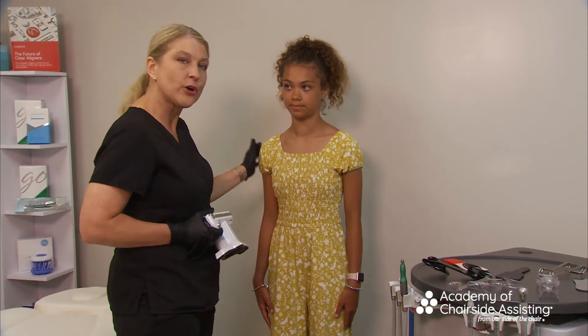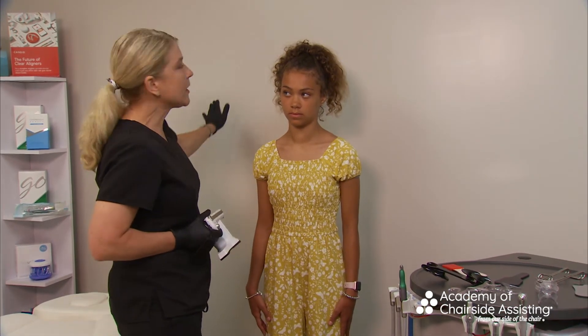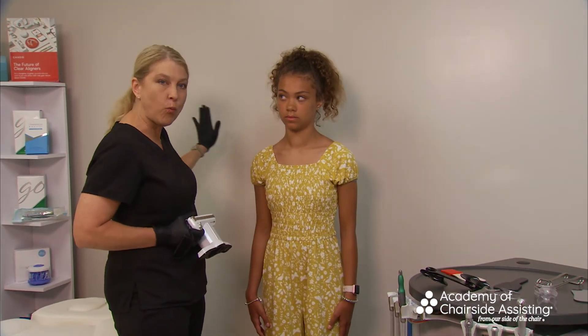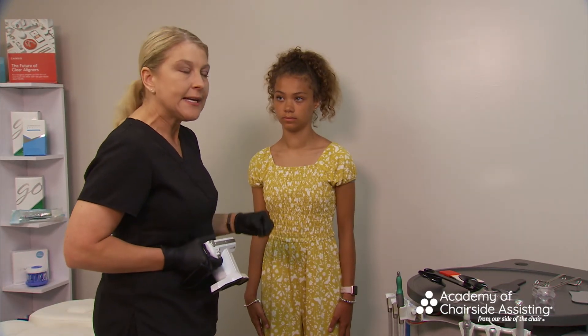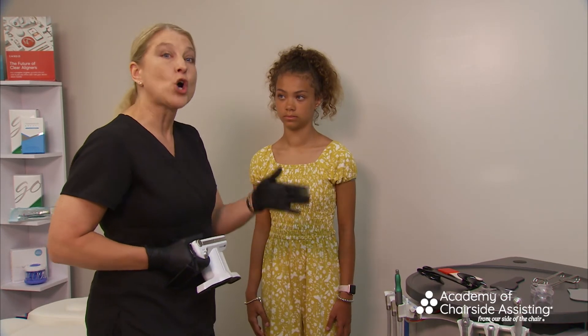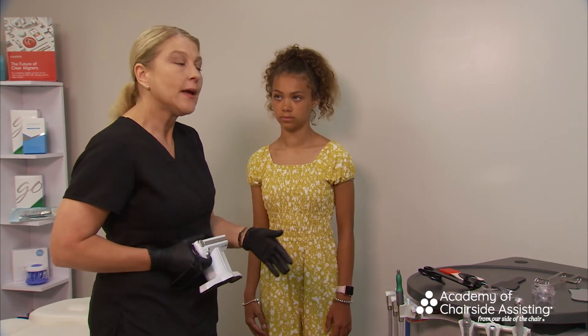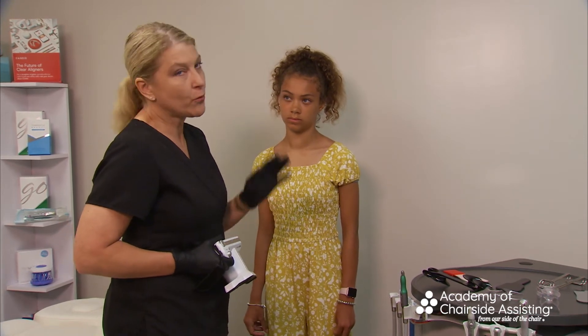Notice Kylie is very close to the wall — that can create a shadow on the patient. So I'll have her take a few steps forward. Also think about your backdrop: wallpaper or blinds can be distracting. I'll show you later what happens with a darker background, but today we're using a light background.